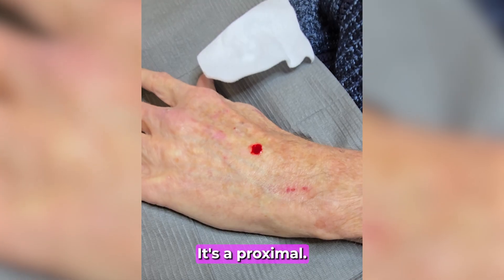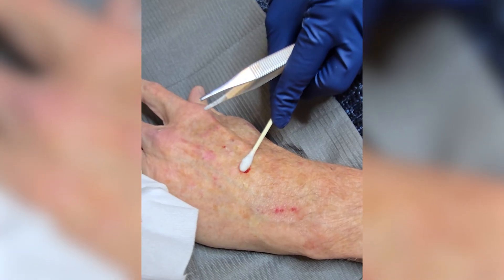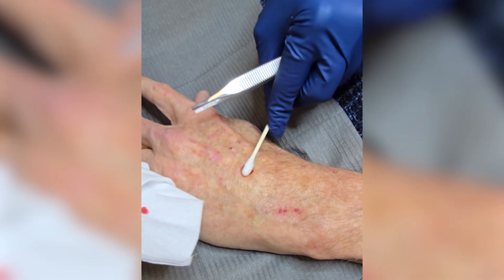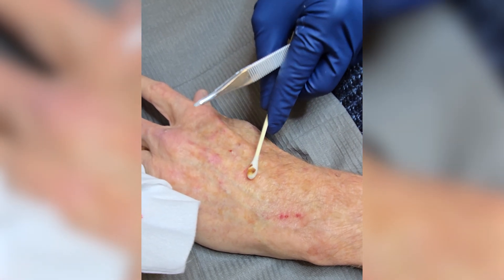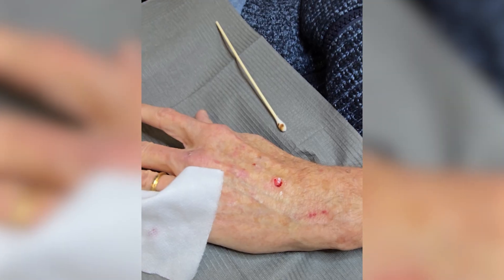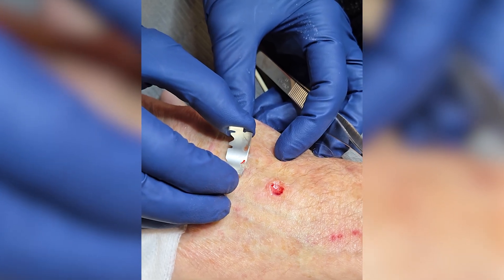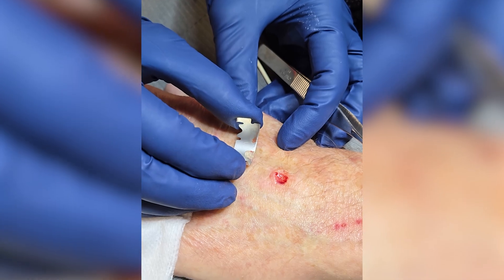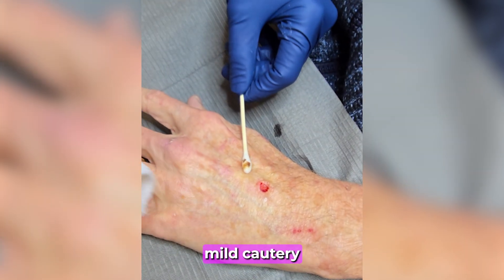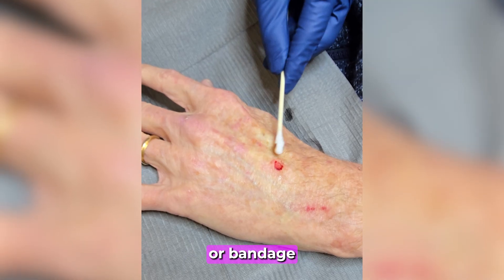This technique allows for complete removal of the damaged tissue while preserving healthy skin underneath. After the lesion is removed, we apply a mild cautery or hemostatic agent to control any minor bleeding. An antibiotic ointment is applied to promote healing, followed by a small dressing or bandage to protect the site.